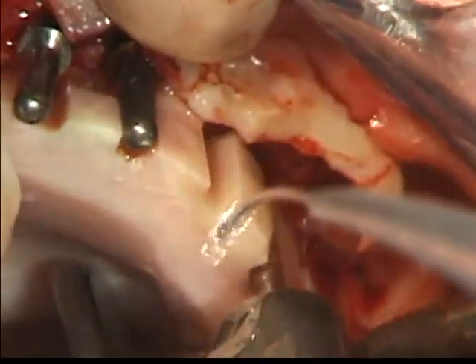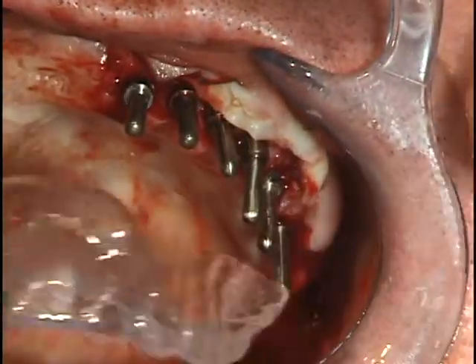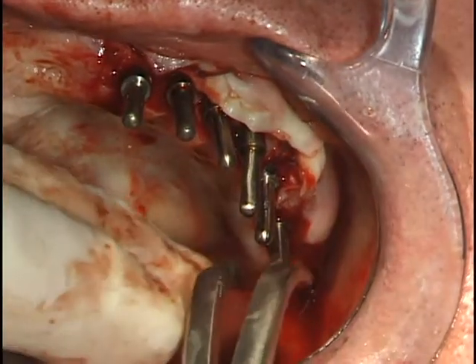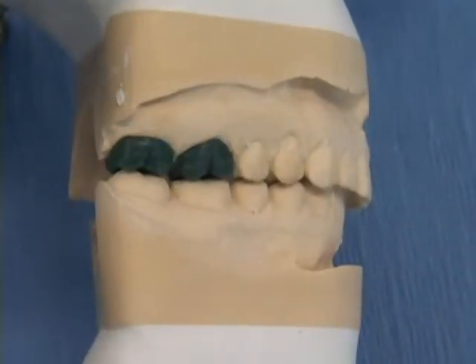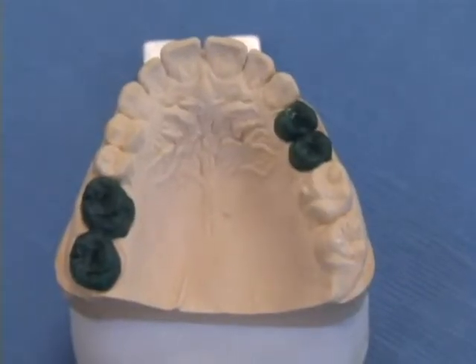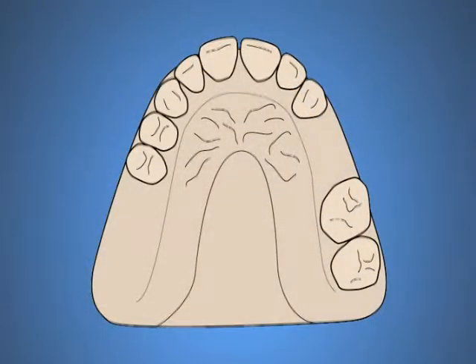To consistently place implants well, it is essential to have knowledge of the intended prosthesis prior to the patient's surgical visit for the fabrication of a surgical template. Mounted casts and a diagnostic wax-up of the teeth to be replaced are usually necessary for the fabrication of a variety of surgical templates that will aid the surgeon in the appropriate placement of an implant.